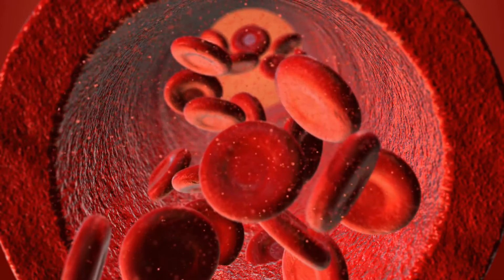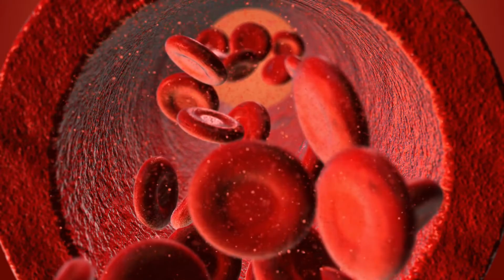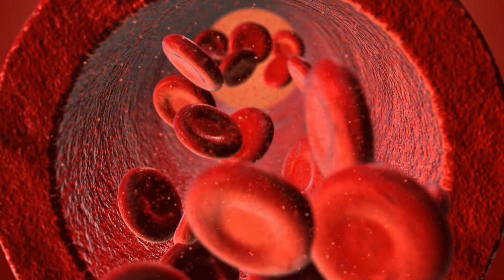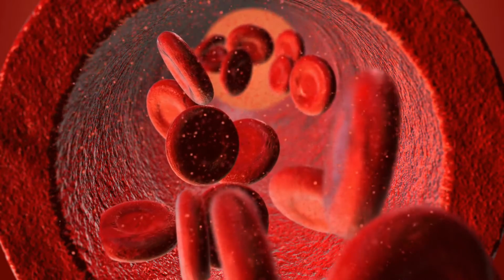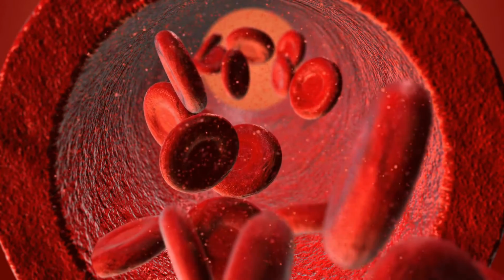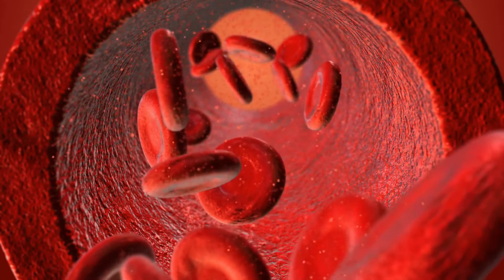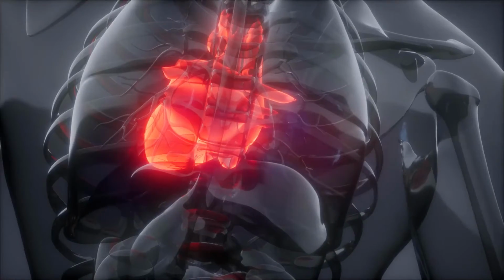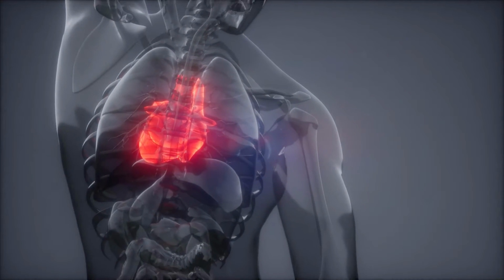Cells in the human body use glucose, a sugar, as the primary energy source to drive all reactions and growth. FDG is a glucose molecule with a radioactive fluorine atom attached. It is radioactive, but it is not strong enough to pose a significant health risk. Typically, a patient undergoing a FDG positron emission tomography scan gets an injection of the FDG into a vein.